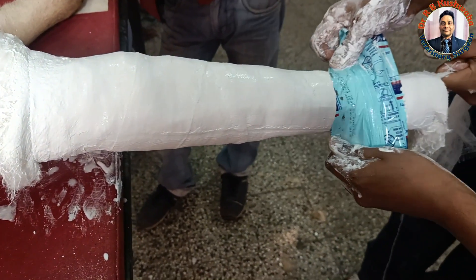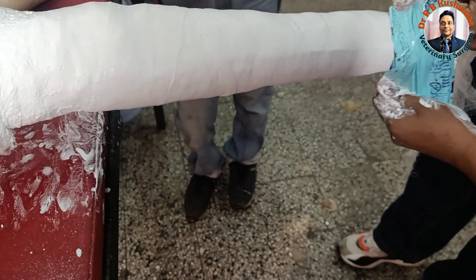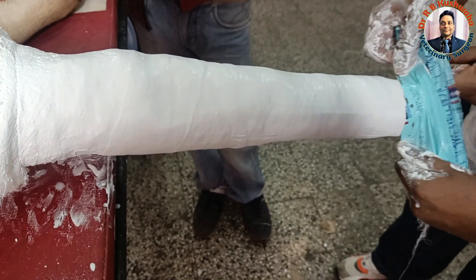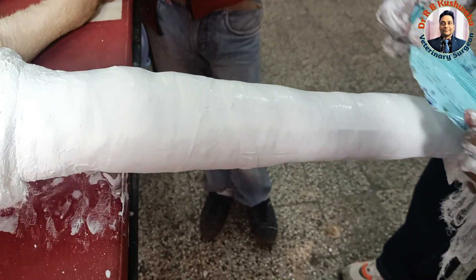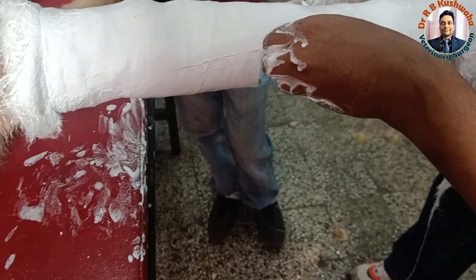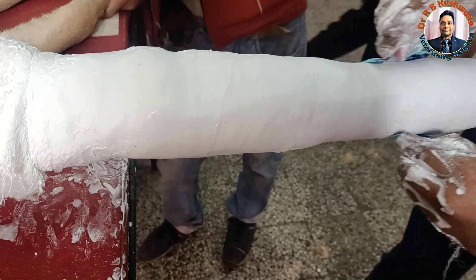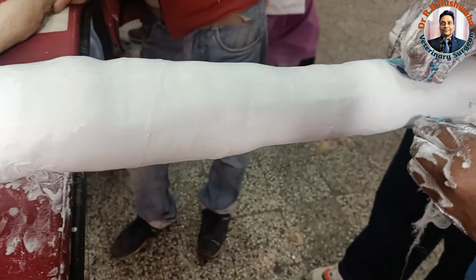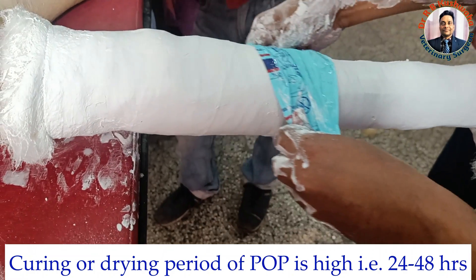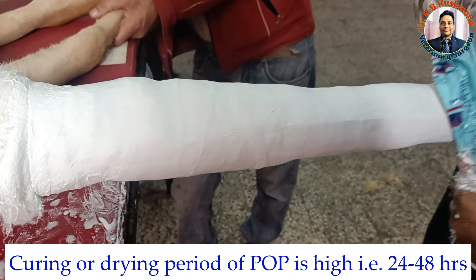This is how we make the surface smoother so that there will be no crack formation. The only problem is that the drying period of the POP bandage is long, but we will try to keep it in this position for at least 30 minutes.